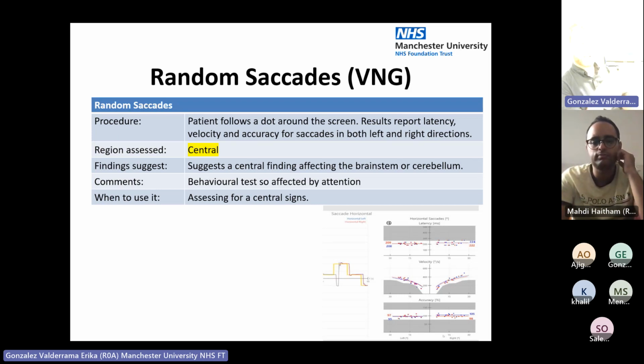Where the vestibular nuclei are, they're on the outside of the pons, and you can often get in older people slightly dodgy saccades and smooth pursuit, because they've just got really bad white matter disease in their brainstem. So this is just basically they have to watch a target moving around on the screen, and their eyes have to track it like that.